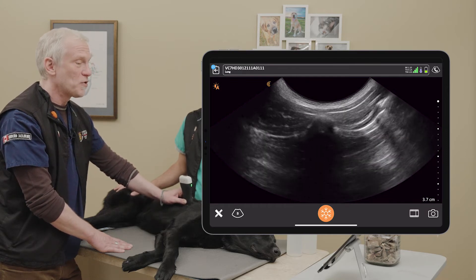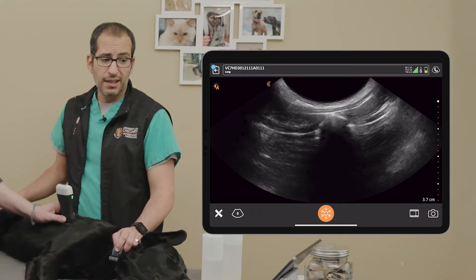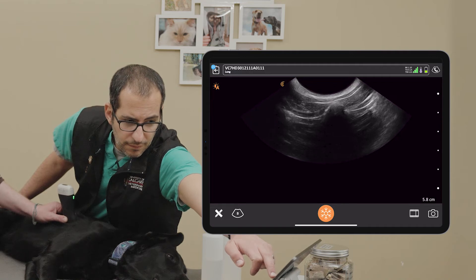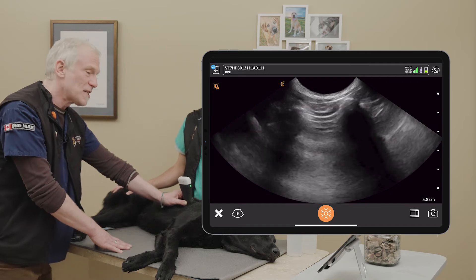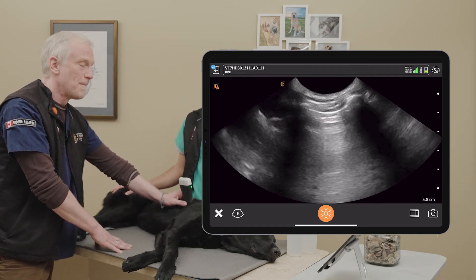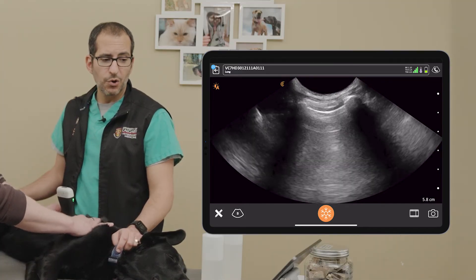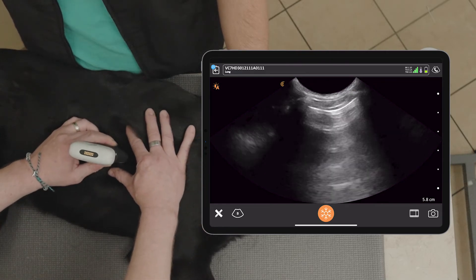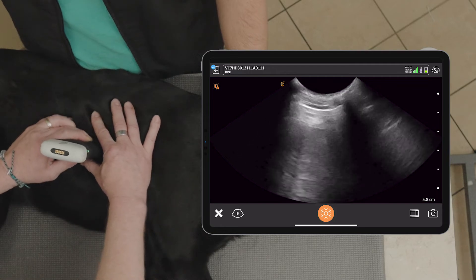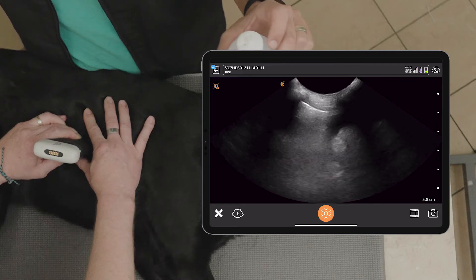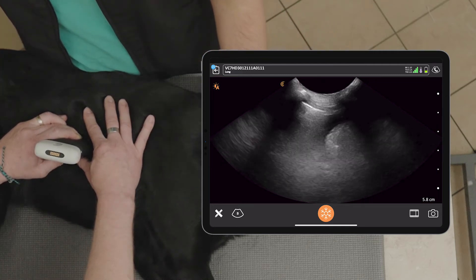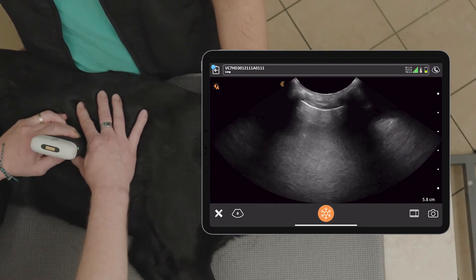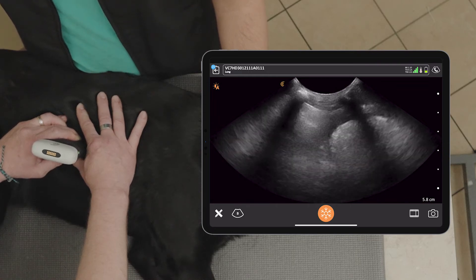Now let's show how we find the different borders. We'll take our depth back out to about six centimeters and turn the gain up. We're going to slide the probe straight caudal to find that caudal border — the curtain sign. We'll slide the skin instead of wetting the entire dog with alcohol, going from air-filled lung to a soft tissue transition. It's going to look like a curtain opening and closing. I can see it coming in right there — that vertical edge artifact. That is the curtain sign, and it literally takes about five seconds to find.